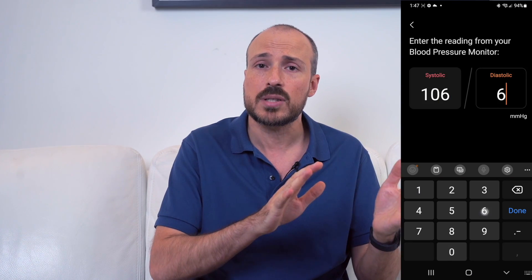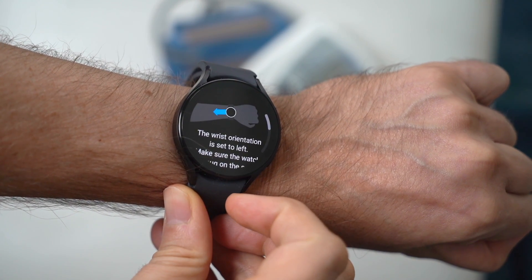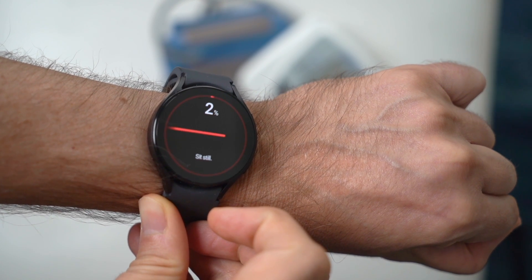Anytime that you do an ECG or a blood pressure reading, that info will sync over to the Samsung Health app for you to see it. After a while, as you do more of them, you'll get aggregate data — what was your average for a week, what was your average for a month. That data may be something worthwhile to share with your doctor.